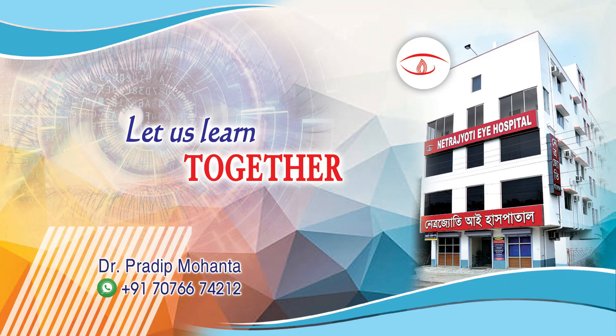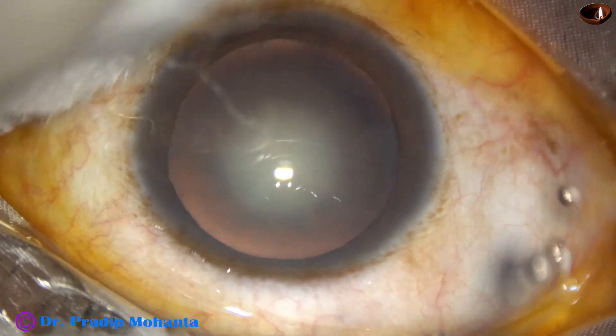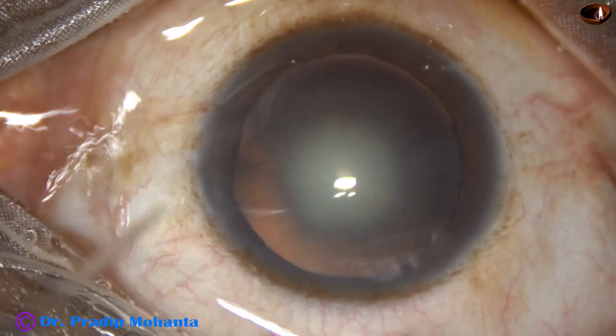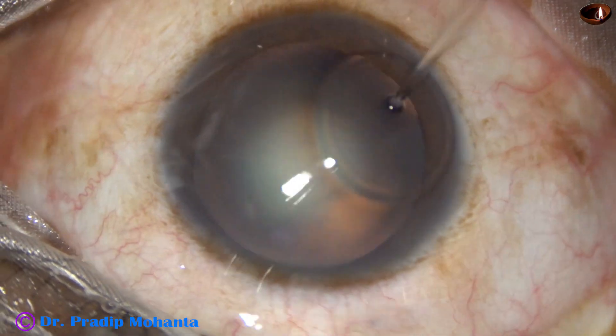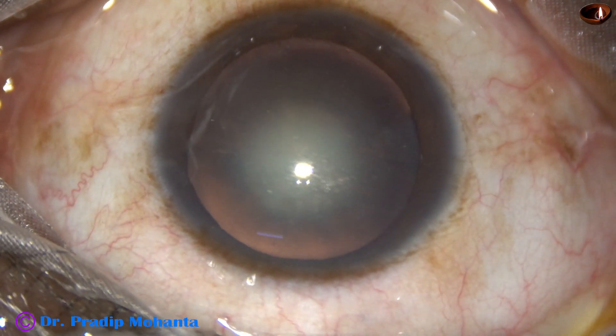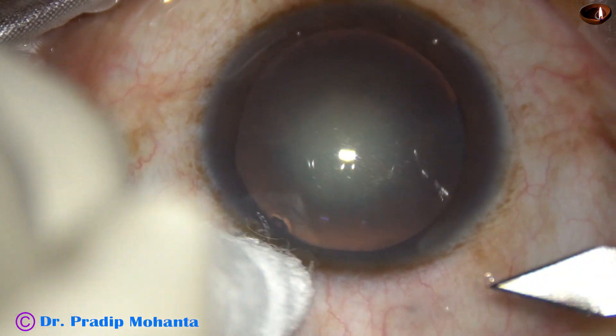In this video, we are going to learn the stop and chop technique of phacoemulsification. The ocular surface is thoroughly irrigated with Ringer's lactate or BSS, applying a few drops of povidone iodine. We can see that this is a cataract with grade 2 nuclear sclerosis.